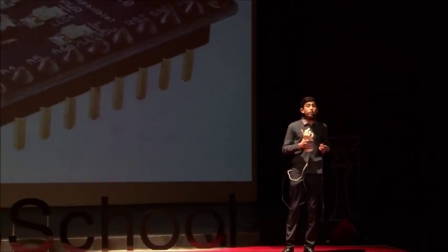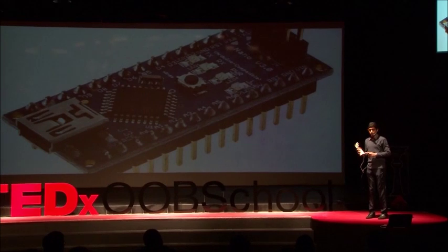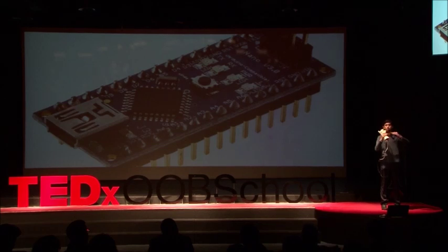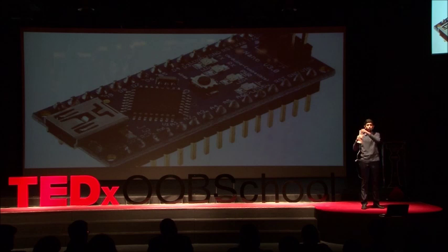I spent some time figuring out how it worked and later modified it so I could get the data from it onto a microcontroller. You'll remember the live attention data I talked about in the beginning? That data is transmitted from the headset to a microcontroller in the hand. And the microcontroller has a very simple task: compare the live attention to a certain threshold, for example 50%, which is adjusted depending on the ability of the amputee to concentrate. Whenever the attention is above 50%, the hand closes, and whenever it's under 50%, the hand opens.